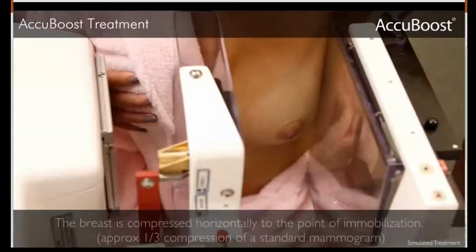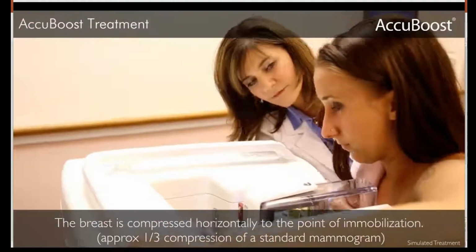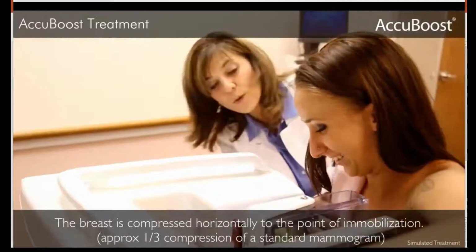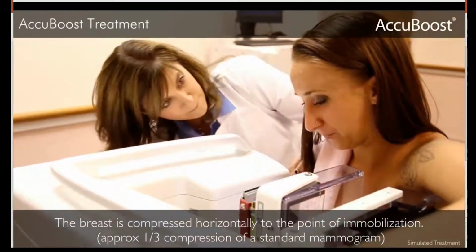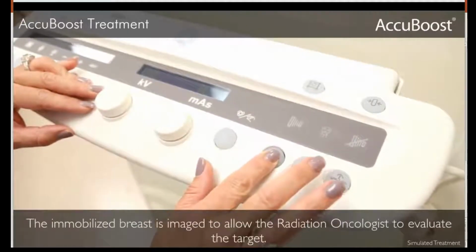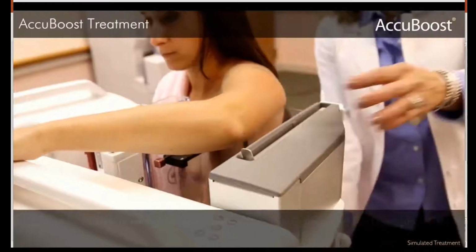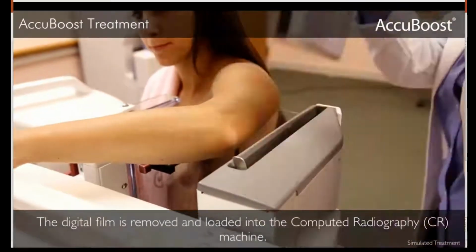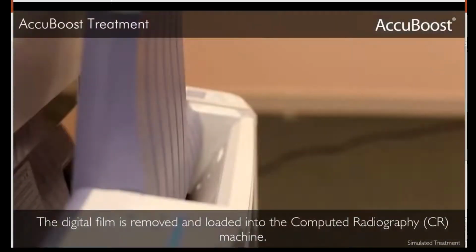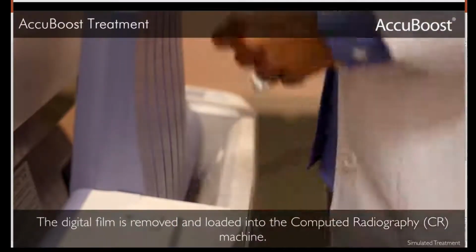And again, most of my talk today will be on the application of AccuBoost for boost radiation. For typical boost treatment, we will only treat one axis on any given treatment day, and then the next treatment day we'll treat the other axis. For accelerated partial breast radiation, as I'll talk about, we do both axes on any given treatment day.